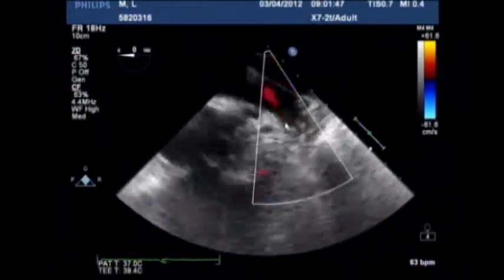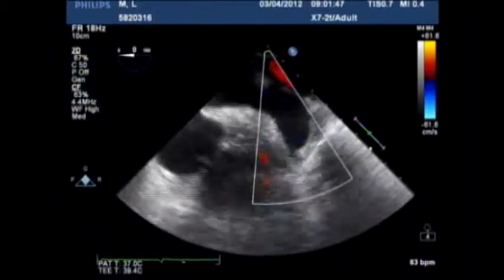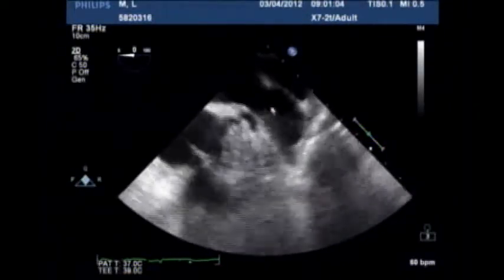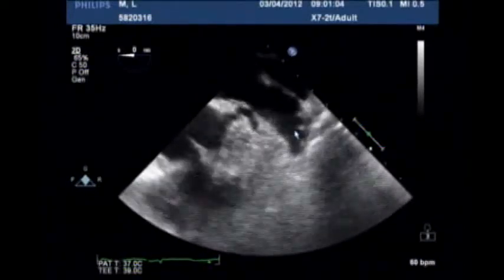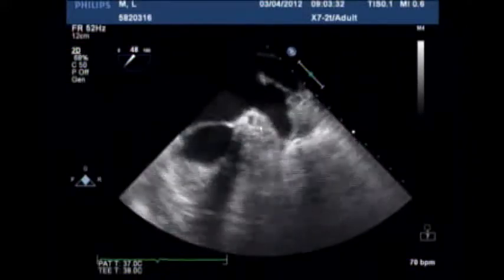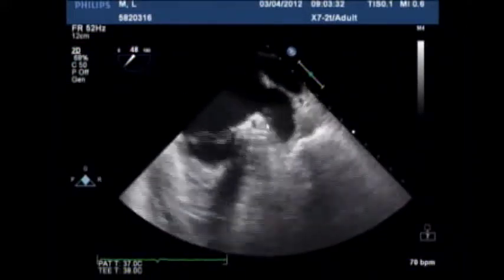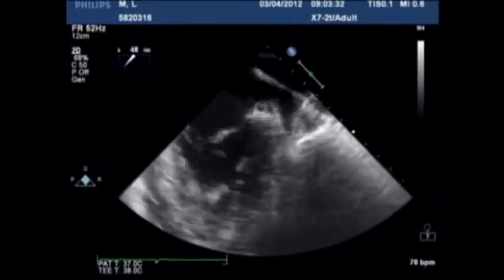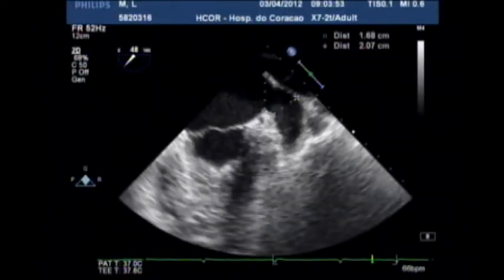This is the flow in the left atrial appendage. There is no thrombi or anything like this. So here in 48 degrees, you can see the circumflex coronary artery here, and this is the appendage. And I'll start showing some of the pictures we've got here.